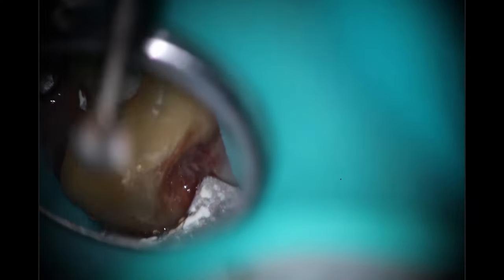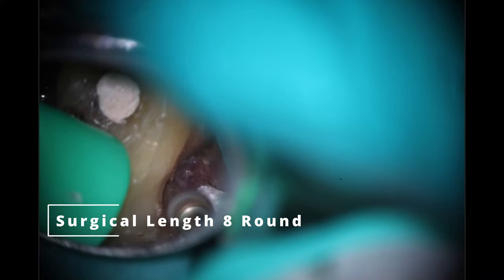So just confirming that there still is decay. The dentist did let me know that the decay was getting really deep, and he'd elected to stop before it got too deep. So I'm going to start off with my surgical length 8, because nothing else is long enough to get inside there, and I'm just going to remove anything that feels really soft. You'll see at the end how I managed the decay with a trick I like to use in cases like this.